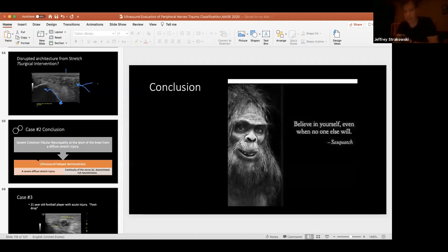So I will try to see the whole thing when there's something pathologic that I want to scan. If I know the injury is at the wrist, I won't necessarily do that. But if I'm looking at the dorsal scapular nerve, I'm going to look at it everywhere I can if I'm worried there's an injury there. I most certainly want to see it coming off the C5 root. You can see branches, and if it has secondary branches, look and see if it has an anatomic variation that might impact the result clinically. You might even have one part of it injured and another part not.